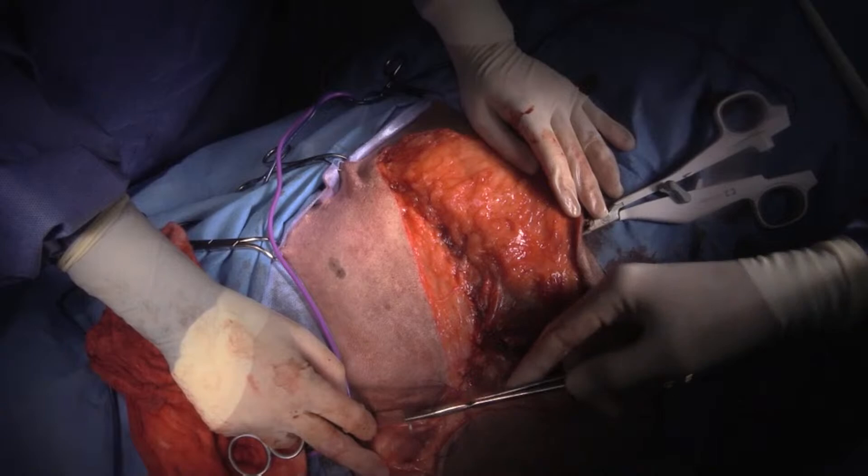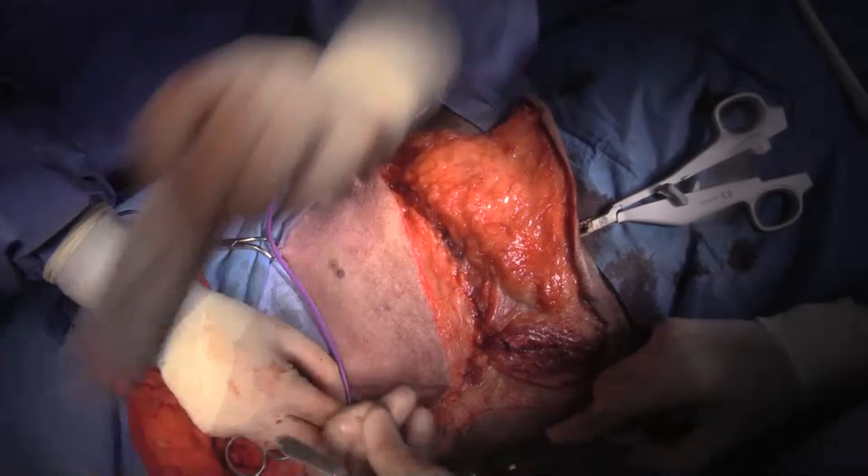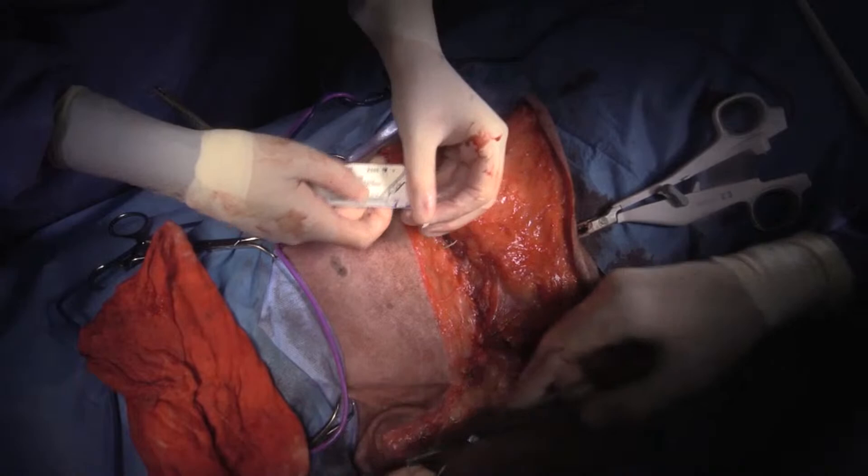So I've just closed my trapezius and omotransversarius down to my superficial pectoral muscle here.